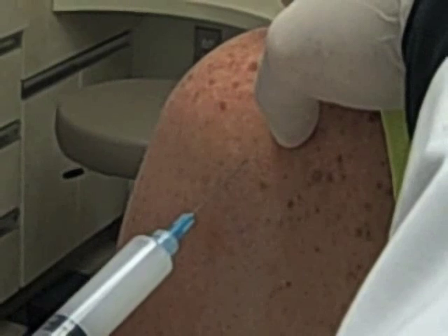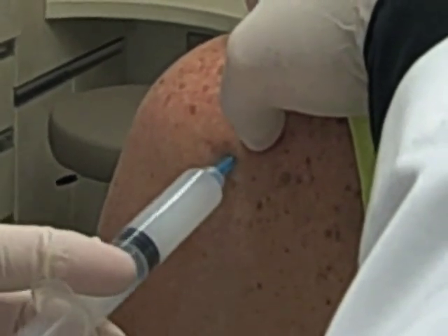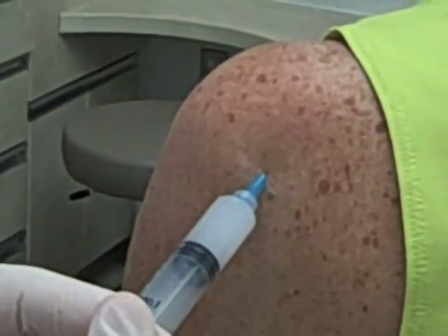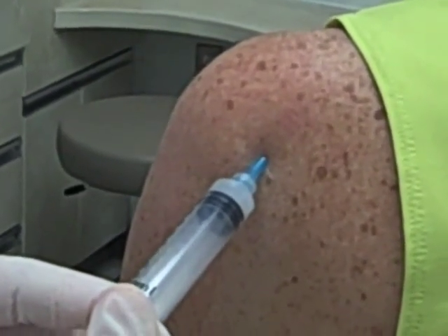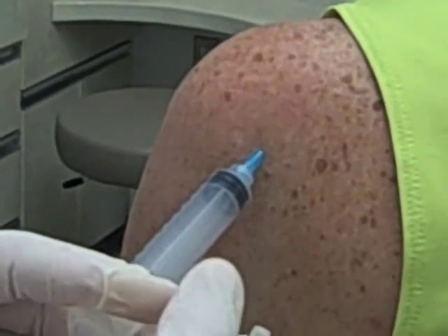With the non-dominant hand on top of the shoulder, we identify the coracoid process anteriorly and apply some pressure. We proceed with a 45-degree angle towards the coracoid process. Once in the subacromial space, we inject the medication. In case we find any resistance, we reposition the needle until the medication flows easily.